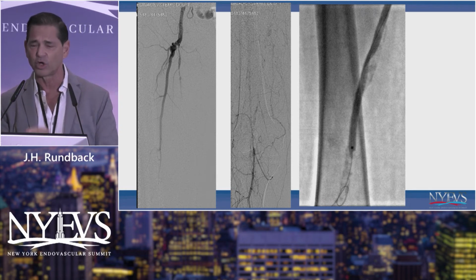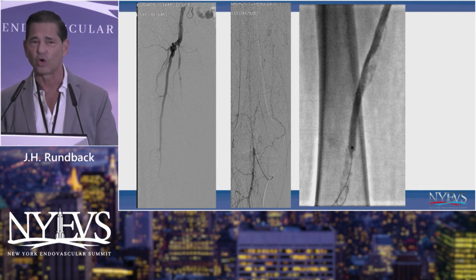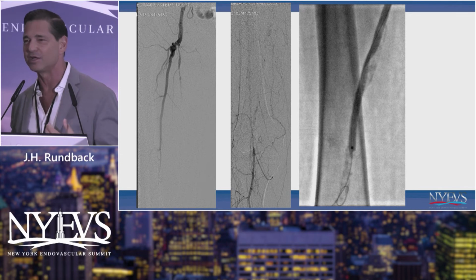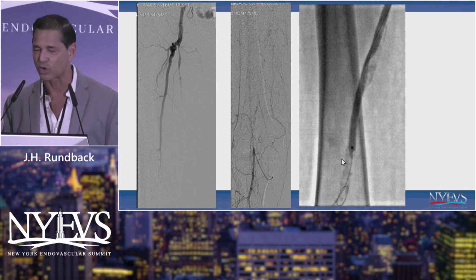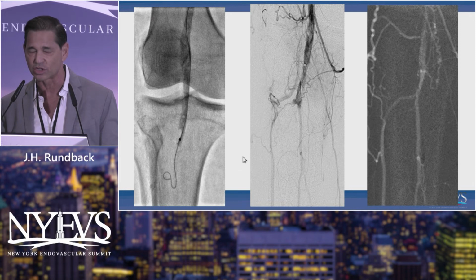So often, if you have a balloon, you're kind of dilating as you go to creating space. But if you do that, don't dilate down to the point where you may want to use a re-entry catheter because you created too much space and your needle now won't bridge over into the patent lumen. So you can see I sort of stopped short with my balloon here, not all the way to the point where I'm going to plan to re-enter based on the angiographic demonstration of reconstitution.